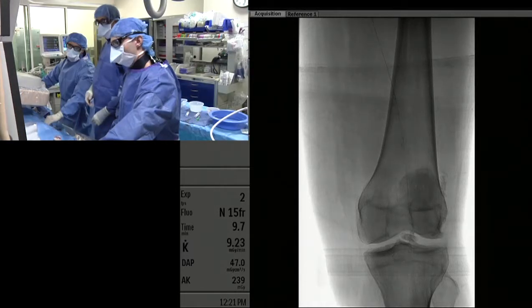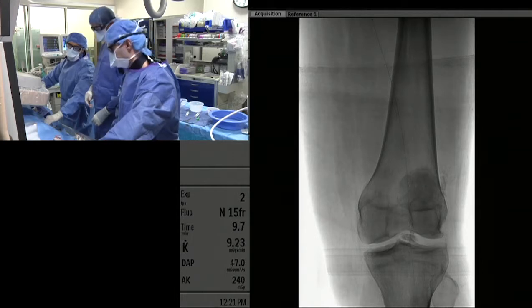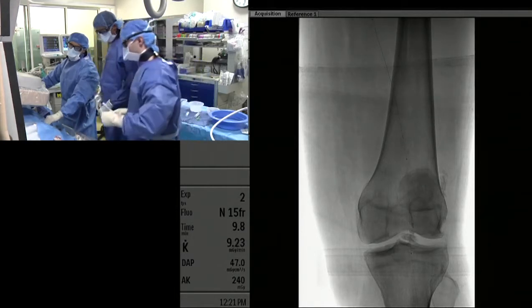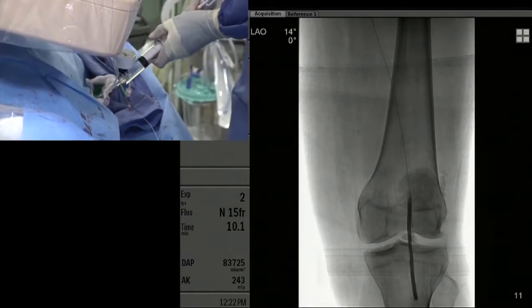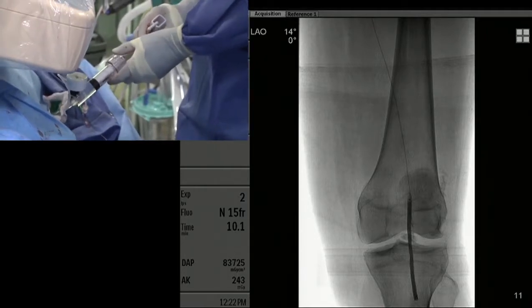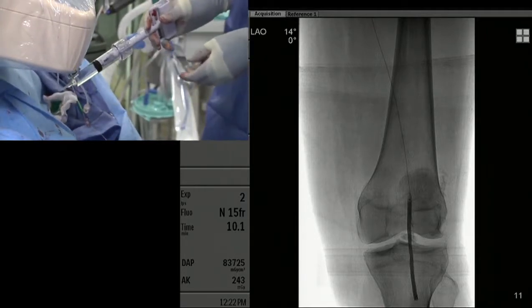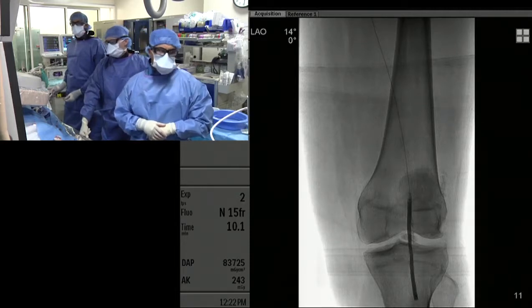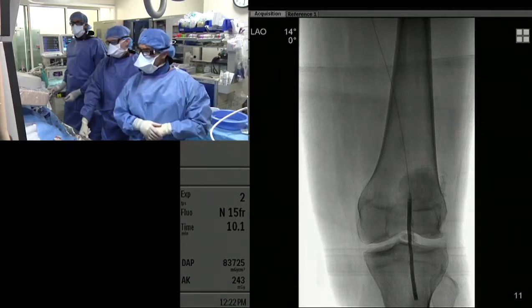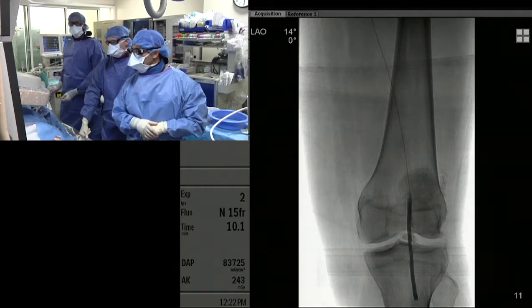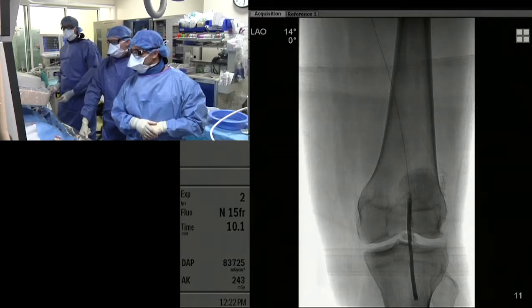You can see this is the Pacific Plus balloon. Unfortunately, we only have a shorter length. I thought a 4-millimeter balloon was adequate here. Would anybody use a larger balloon? Based on the original run, the balloon looks well-matched to the natural arterial size, so probably not in the popliteal area — though you might switch to a 5 higher up.